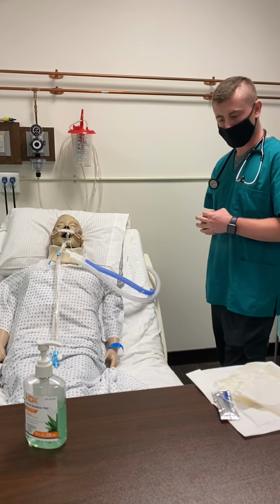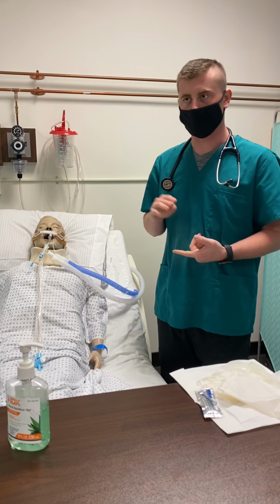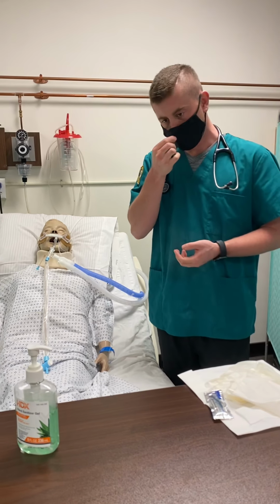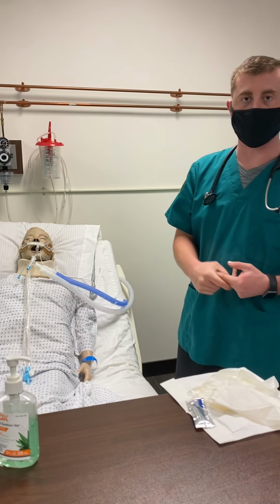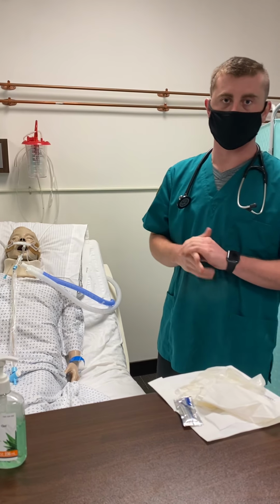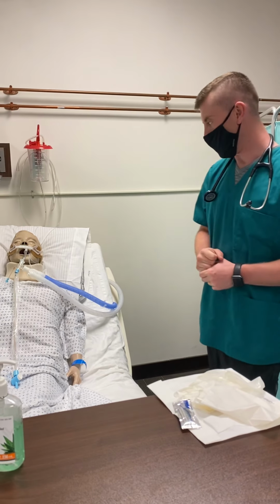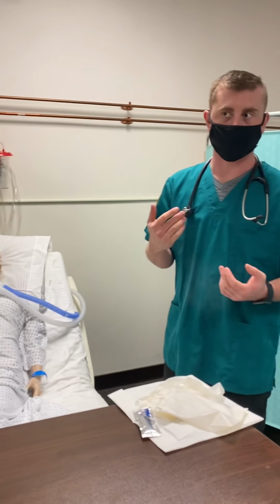So to start off, I will assess the patient: vital signs, general appearance, breath sounds. I would then pre-oxygenate the patient with 100% FiO2 to get the patient's oxygen saturation to 100%. This patient would be on a ventilator right now, so I would do that on the ventilator.